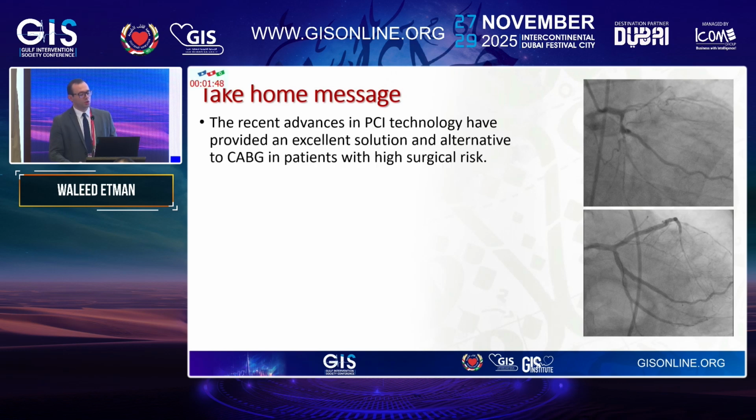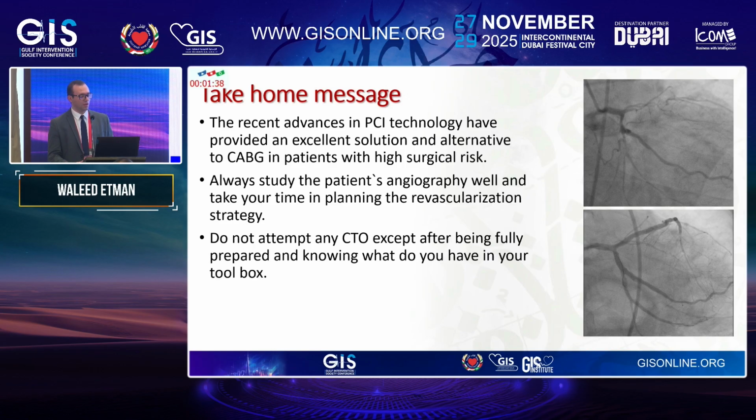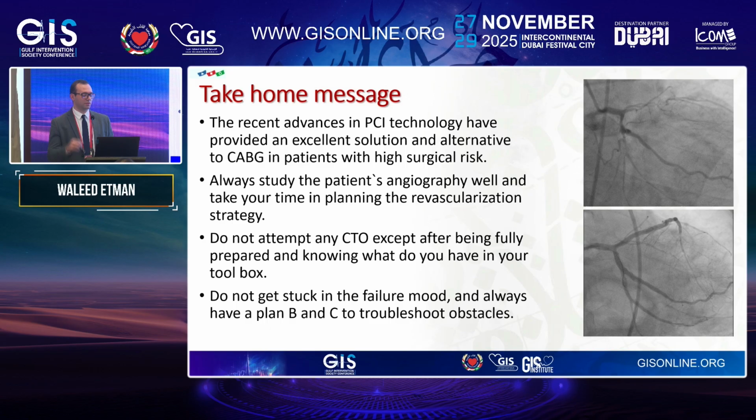So my take-home message is that recent advances in PCI technology have provided an excellent solution and an alternative to CABG in patients with high surgical risk. Always study the patient's angiography well and take your time in planning the revascularization strategy. Do not attempt any CTO except after being fully prepared and knowing what you have in your toolbox, and do not get stuck in the failure mode, and always have a plan B and C to troubleshoot obstacles.